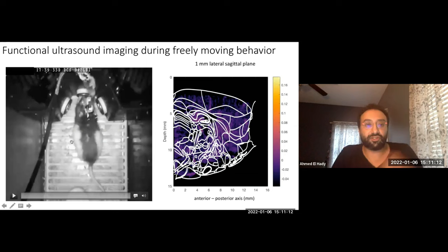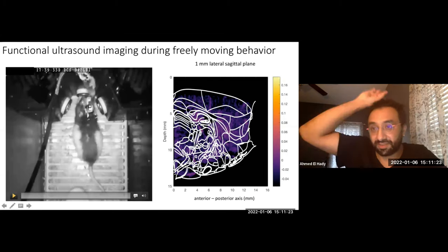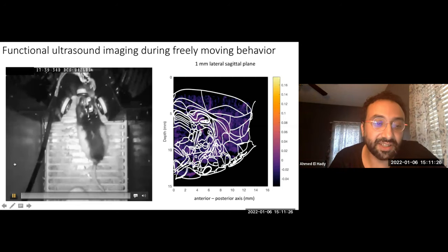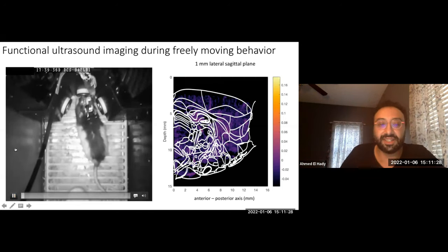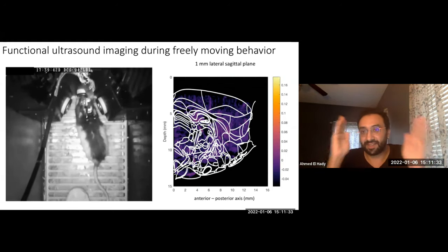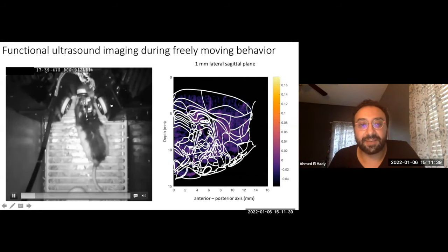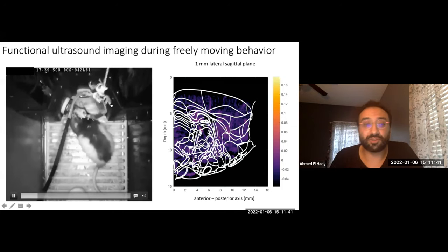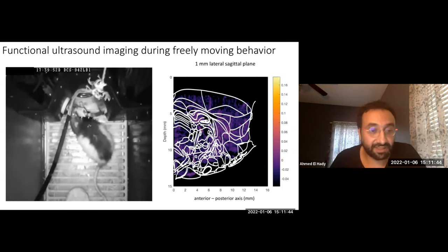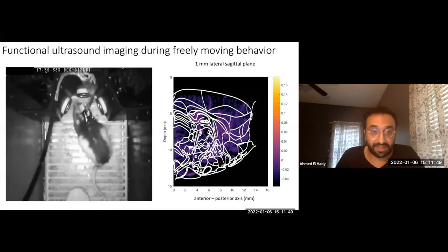Just to give you an intuition, let's look live at how the rat is behaving here. This is the tethering setup I mentioned, and the animal has the ultrasound probe in this probe holder, and it's doing the evidence accumulation task. Sorry, there is no sound here. It's a very good rat, very well trained, just center poking. Now he's listening to right and left clicks, and after 5 seconds, he will leave the center poke and go to the side of the clicks. He'll keep repeating this many times; we can get on average 200 to 300 trials a session.